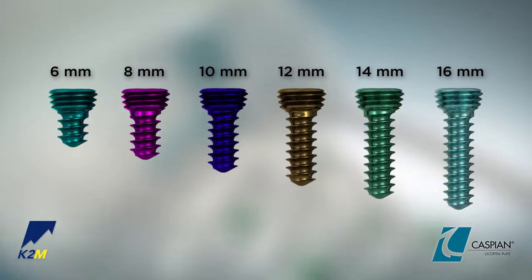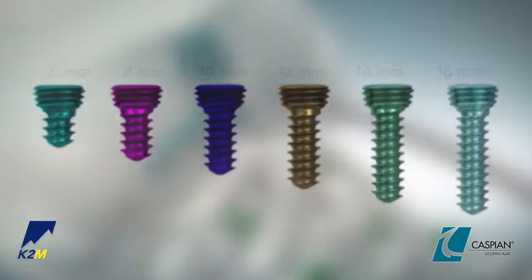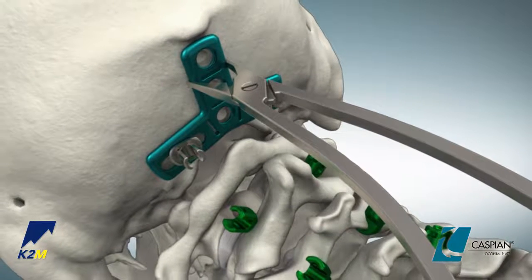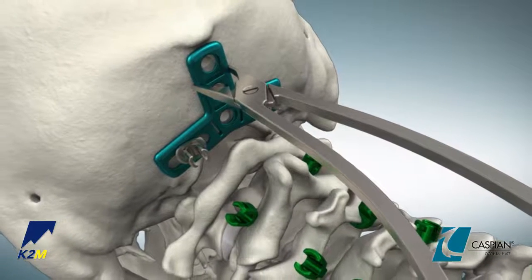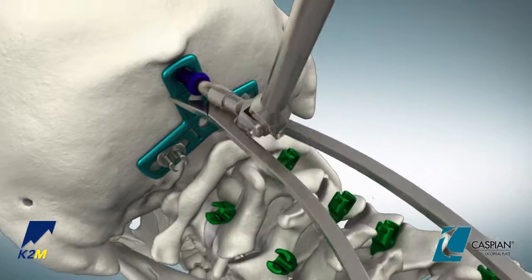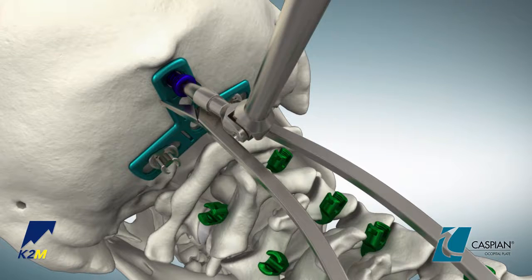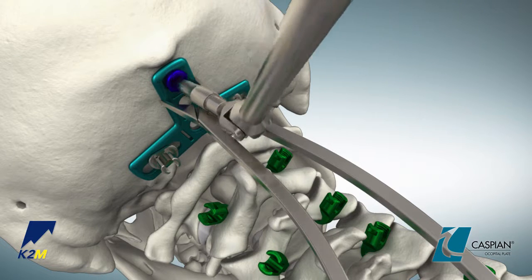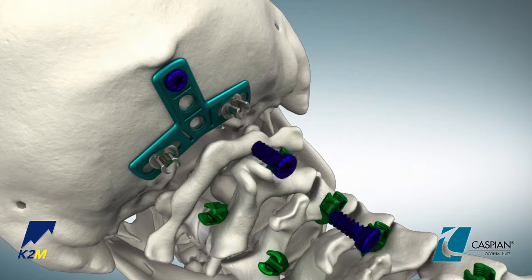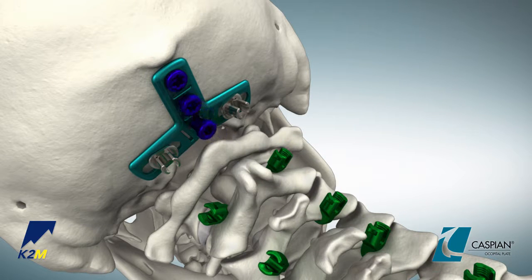16 millimeter screws are available upon request. Prior to screw insertion, remember to make sure the plate is properly positioned as the plate will not lag to the bone. With the appropriate screw selected, use the size 20 tapered screwdriver or universal joint screwdriver in conjunction with a fixed or ratcheting axial handle to insert the screw and provisionally tighten. Repeat until all screws have been inserted.